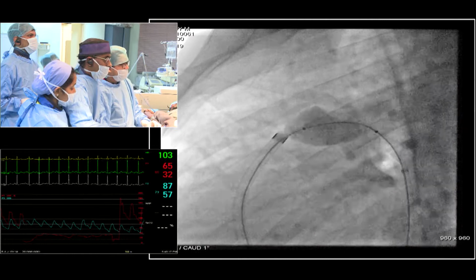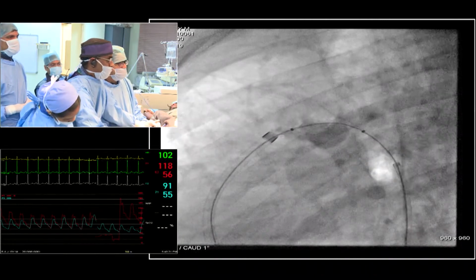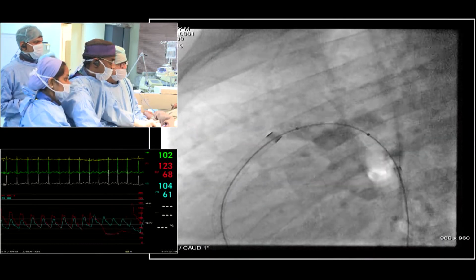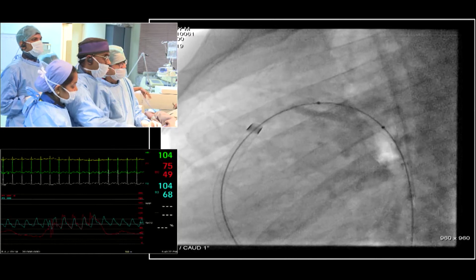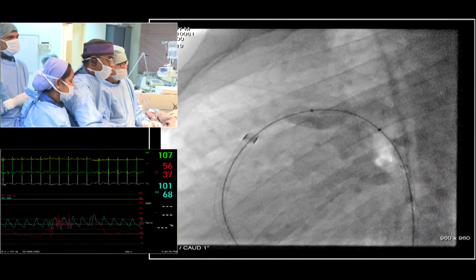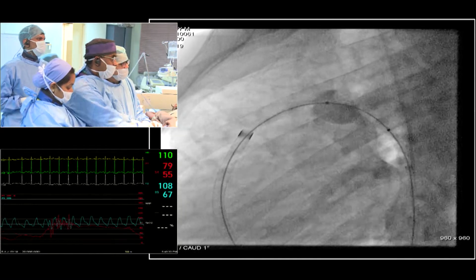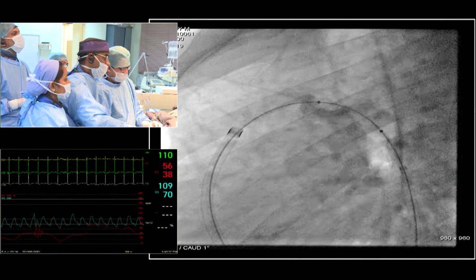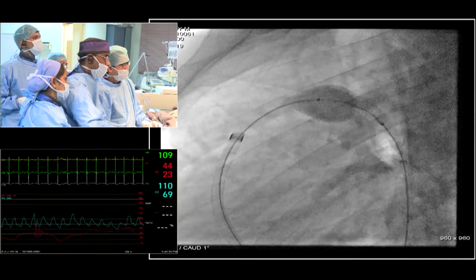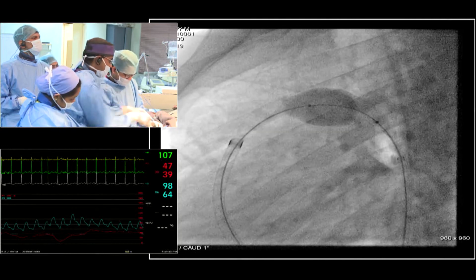Tell us as you're doing this, what will you be looking for? I'm showing the hemodynamics on your small screen. Can you see that also? Yeah. So practically, basically, I'm trying to get the middle of the balloon on the ductus. You are giving a small pull, Sandeep. You have to continuously keep pulling. Not that one, not the wire.